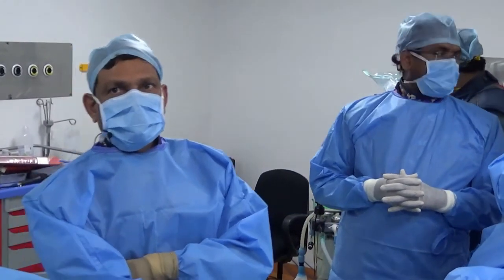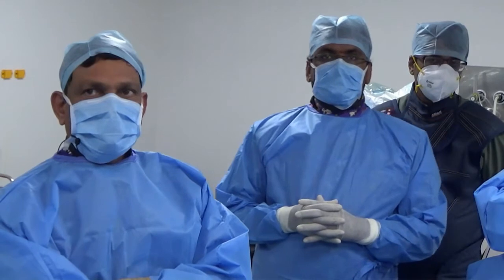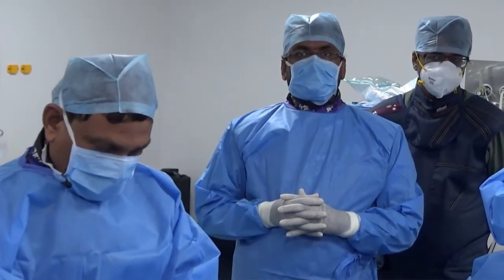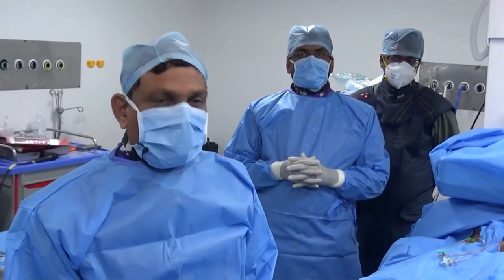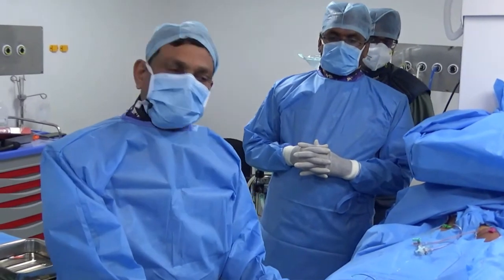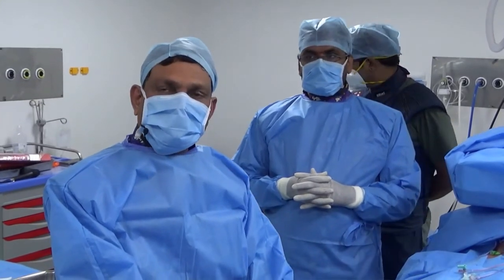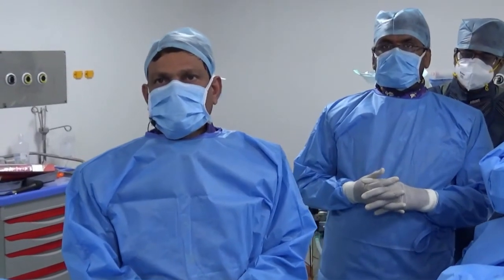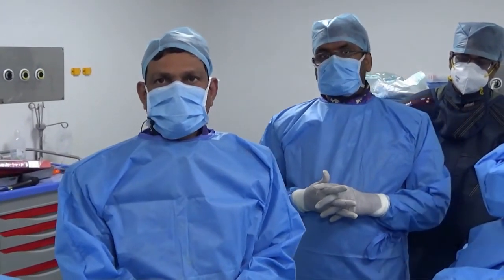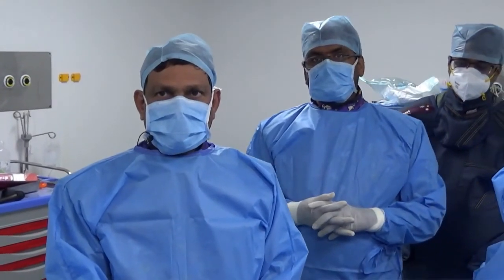Because of remodeling of the arteries, sometimes the aneurysms growing very rapidly in children is not uncommon. One of the reasons why these fistulae are closed early is for that, because the remodeling of the arteries is huge. And also I want to tell that if it is an end artery fistula like this, the aneurysmal segment is going to be a continuous process. Absolutely. If you close, that is the point, I think, which justifies you doing it, Nageshwar, now. Because if you take another couple of years, this will become completely aneurysmal. Then the likelihood of thrombus is even higher. So by closing it now, you prevent subsequent dilatation. I think that may be a reasonable justification in doing it.